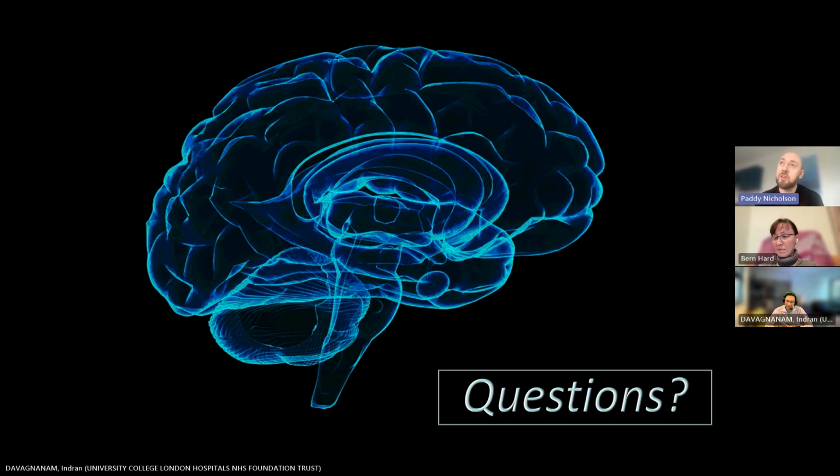Same thing with a so-called Chiari malformation, where you can get tonsillar descent. I suspect in the past, many of these patients were mistaken for having a Chiari malformation. So for me, any of those signs is a reminder to check the brain for other signs of spontaneous intracranial hypotension.